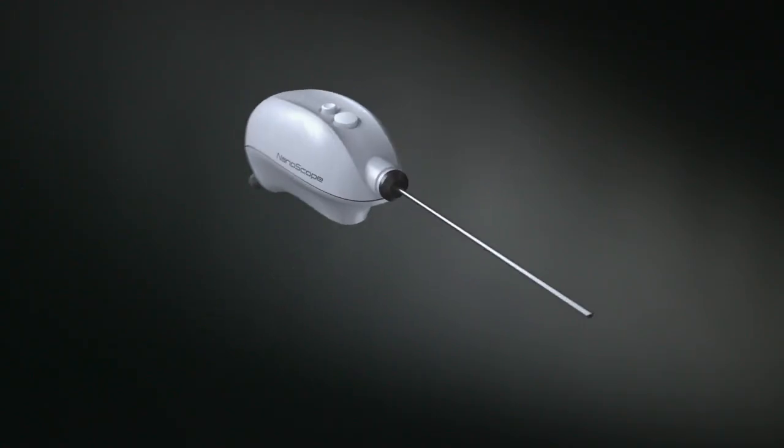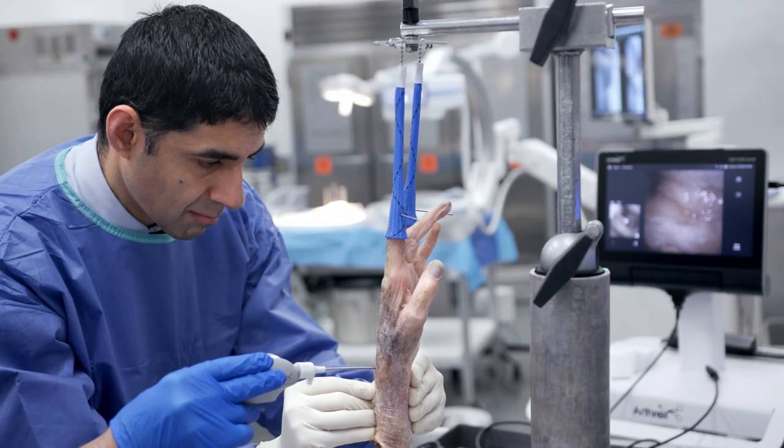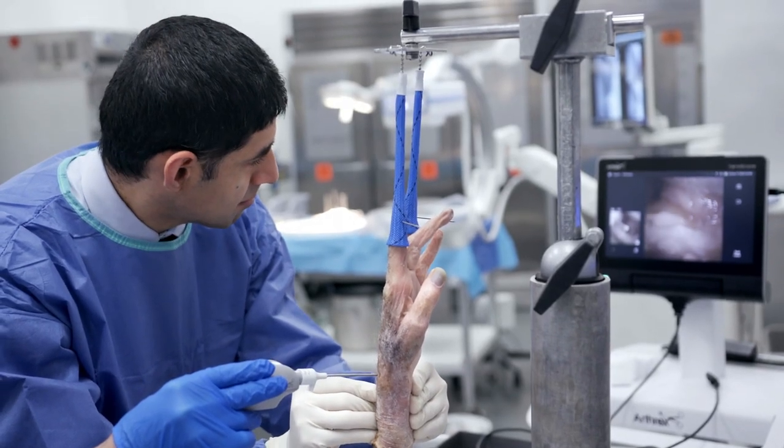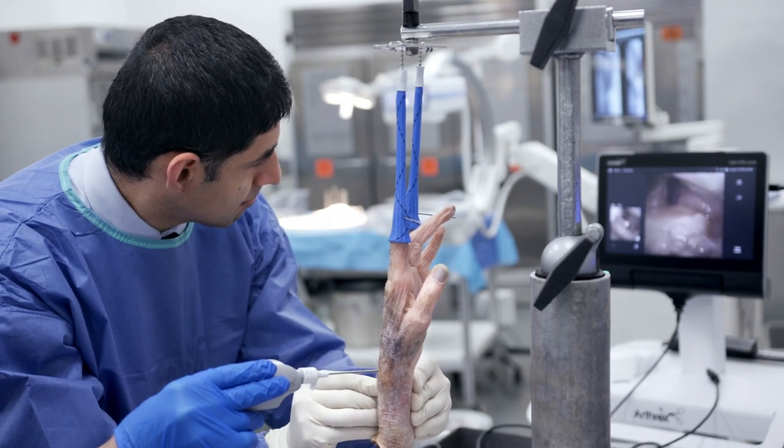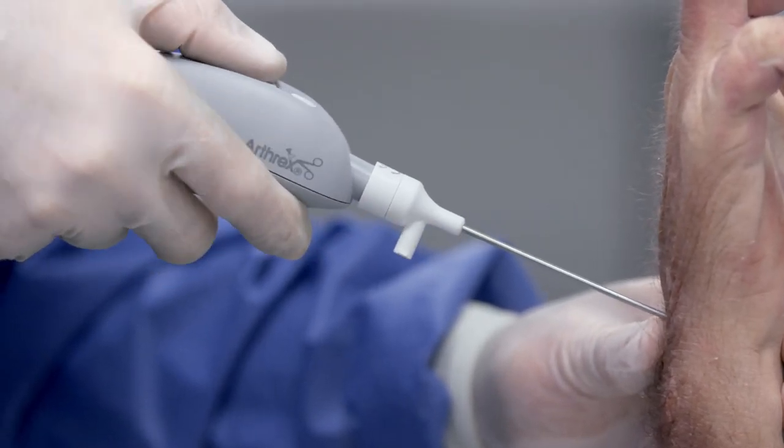The first time that I saw the nanoscope technology I was totally enthused about it. It's like a disruptive technology to orthopedic surgery, not just hand and wrist surgery. It allows us to really expand our indications and what we're doing in a more minimally invasive technique, which ultimately will get our patients back quicker, sooner and treat them better.